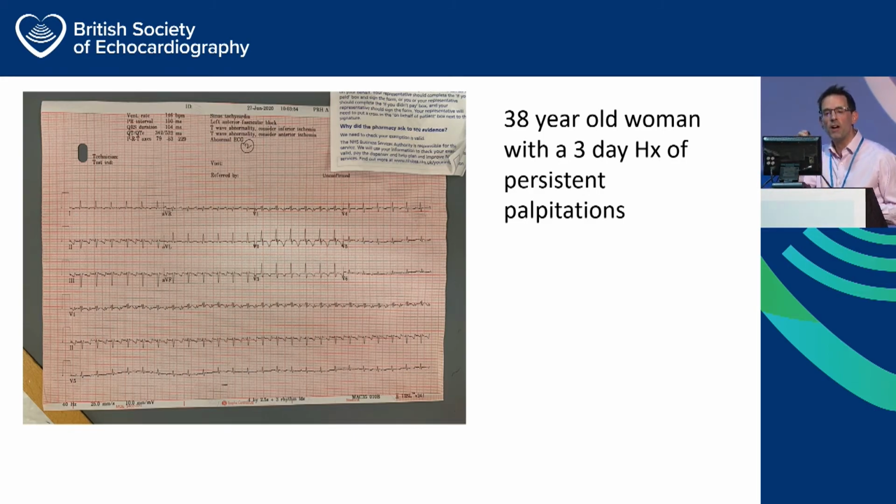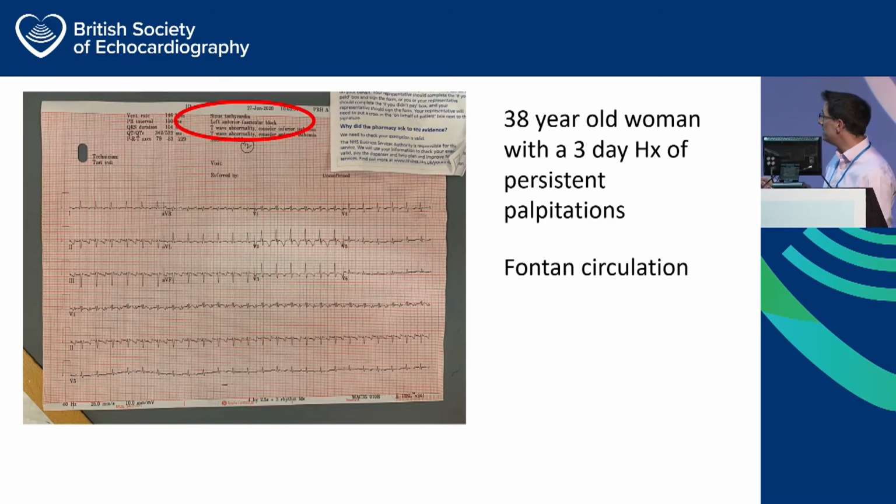Because remember, a sinus tachycardia, which the ECG will tell us there's a sinus tachycardia, varies. So it varies, maybe not over the 10 seconds of your 12-lead ECG, but it varies over a few minutes up and down. It can stay fast, but it varies between 120, 140, whatever.